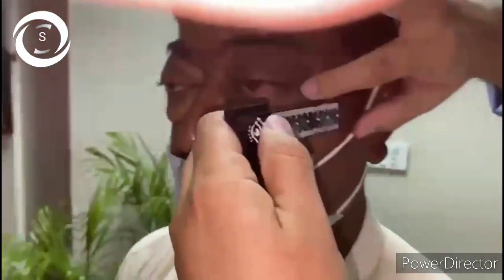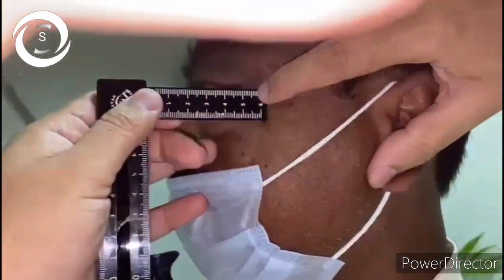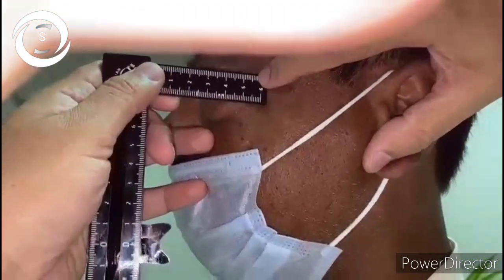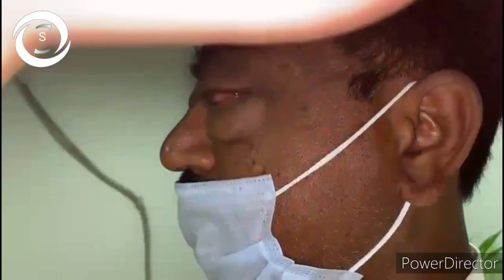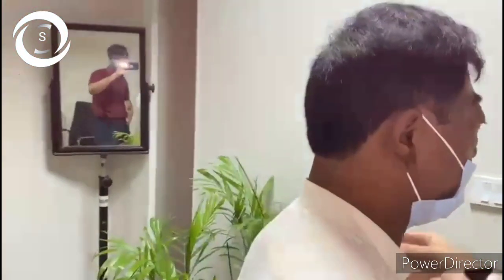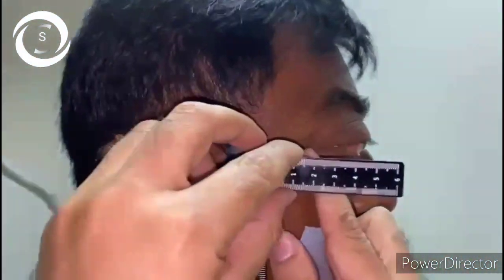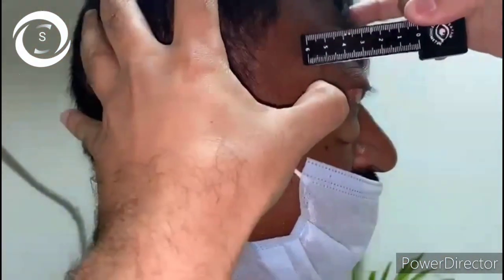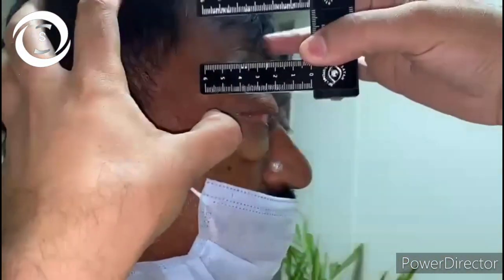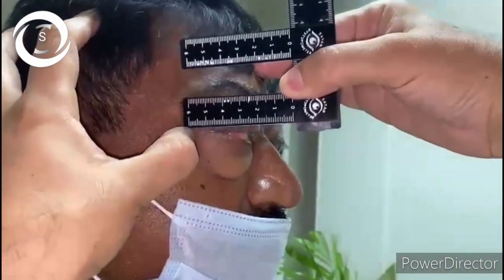And now it can also measure axial proptosis by holding the vertical arm horizontal, palpate the left lateral orbital rim with a finger, put the vertical scale there and measure up to the corneal apex. Now then come to the other eye and note down any asymmetry or not. Asymmetry of 2 or more millimeters is abnormal.